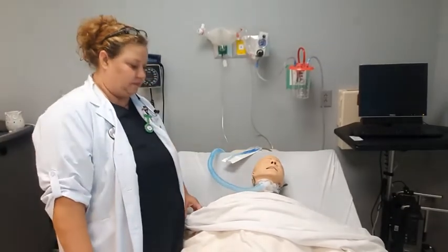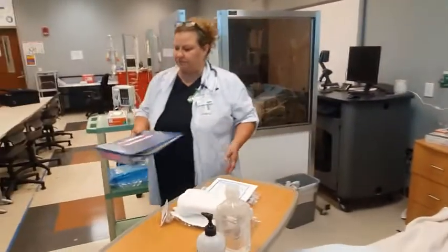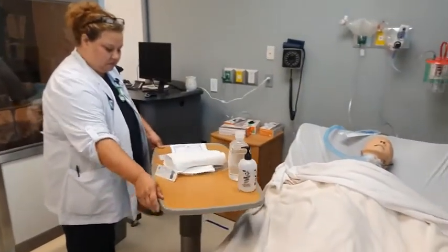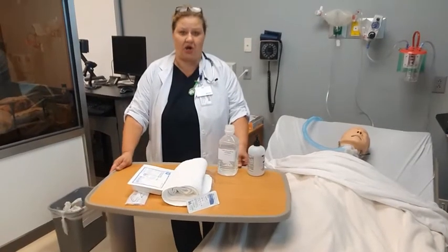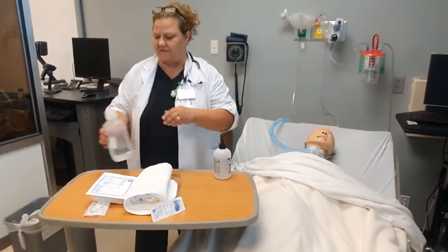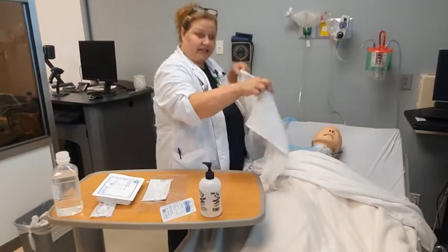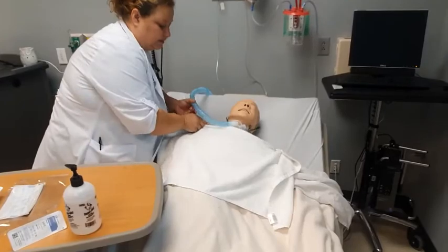Drape their chest with a towel. So, the supplies that we had gathered a while ago, you will bring into the room. I have found that if you slide the table just a little bit right here, that way you can go from here to here and you will not contaminate later on when you're having to do your trach. So you're going to gather the supplies, get everything organized. Like she said, you're going to take the towel. So Mr. Smith, I'm just going to put a towel up here, okay, and drape it across.